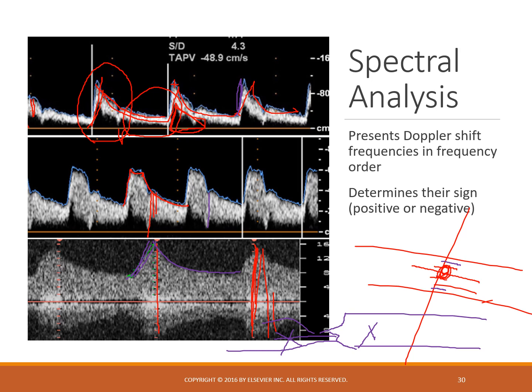And then finally, I am seeing forward flow of blood and backward flow of blood, and all velocities in between, indicating that this is a turbulent area. So this would be pretty indicative of a post-stenotic tardus parvus low resistance waveform.